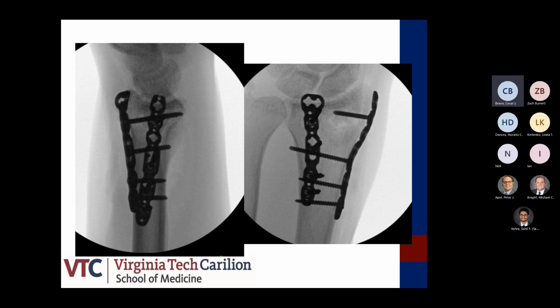Yeah, and I asked because that's one thing with this radial column plate from Synthes. I think the way they designed it was within that septum between the first and second. You can still put it on the first because usually that's where we need to put it. But if it's very comminuted, I mean, you guys got a perfect length. Sometimes you can hyperextend that radial styloid on the lateral. So it tends to hyperextend.